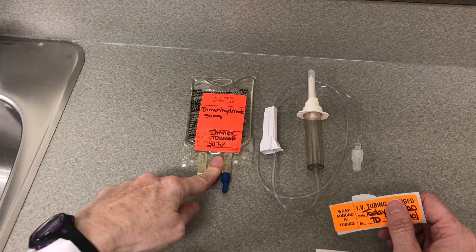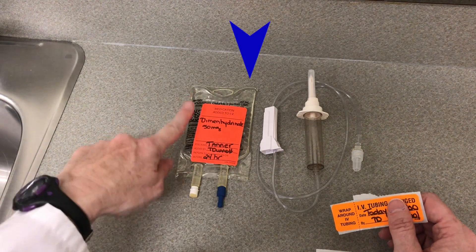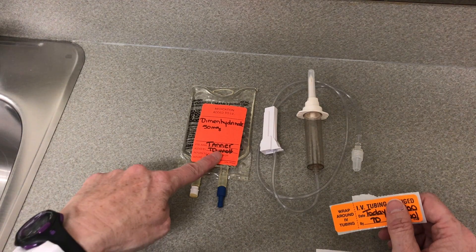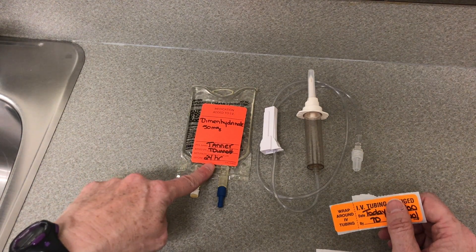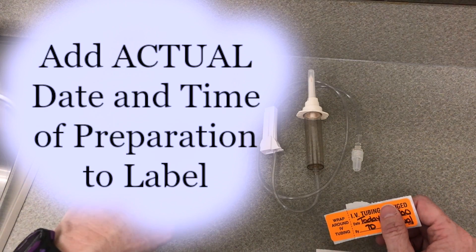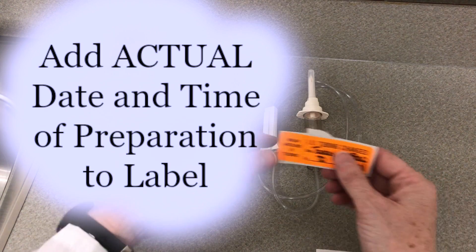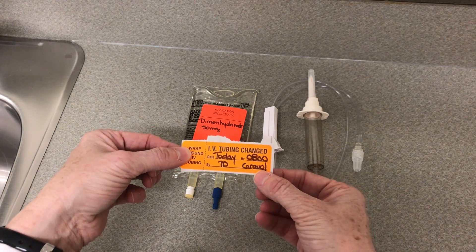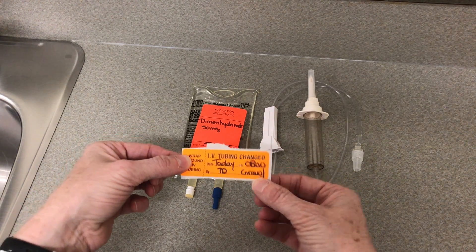Once your medication is in your diluent, I've got my label — dimenhydrinate 50 milligrams. It's for Mr. Tanner. I mixed it and it's good for 24 hours. Depending on your agency, you may put the actual date and time on there. I've also got my label drawn up — it's dated for today at 8 o'clock, my initials, and I'm going to identify that it's Gravol.